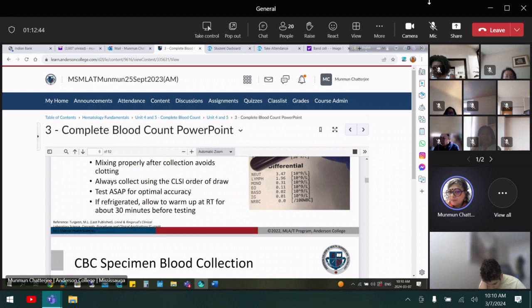That's why there is the question of how long the urine can stay at room temperature, how long the blood can stay outside, and within which time frame you have to make the serum. It takes 30 to 40 minutes to clot the blood to make the serum, but you have to separate the serum within 2 hours. After separating the serum and aliquoting, that serum can stay. Before, it was like that, it could stay only 4 hours, but there is a change now.